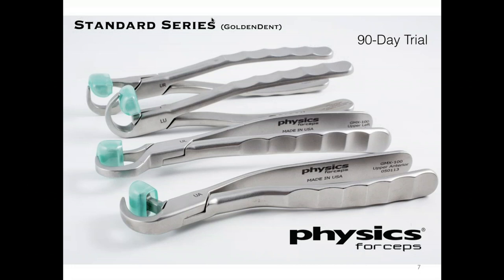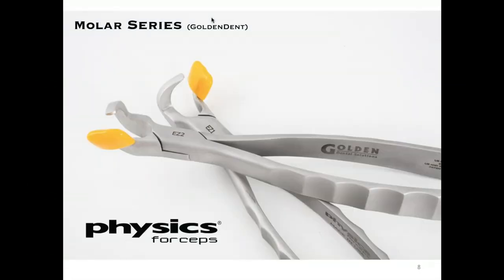And some people on the line may say, well, yeah, I have trouble getting to the second molar sometimes, or definitely the erupted third molars. And that's where you would want to look at the molar set. The molar set's just two instruments. You have an upper right and a lower left, and an upper left and a lower right, if I said that correctly. So they're just used in a crisscross manner.